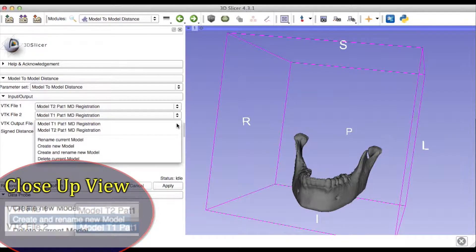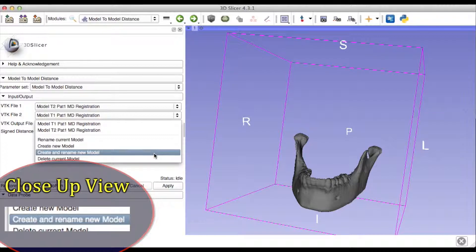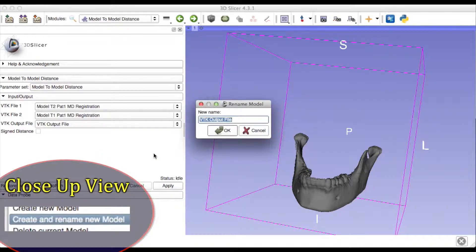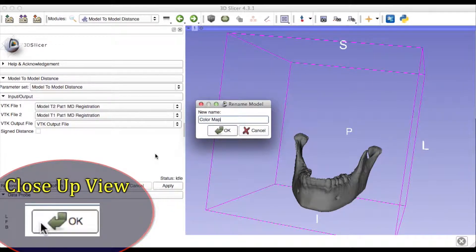For the VTK Output File, select the option Create and Rename New Model. Rename the file as a color map file. Click OK.